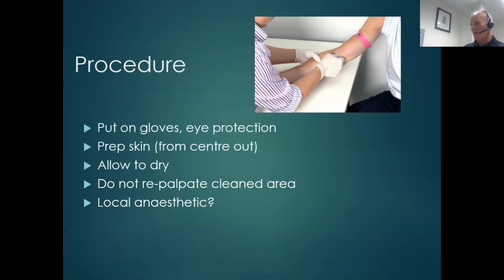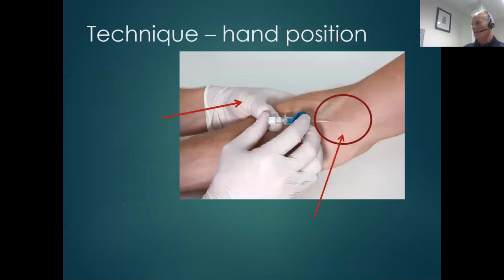Are we using a local anesthetic? The better you get at this, and again, it's all hypersensitivity to needles and patients' reactions, we may need it in some cases, but most times, if you're doing it correctly, it doesn't hurt that much. Uncap the cannula and unlock and rotate, so we want to make sure that the cannula can slide off very easily. Technique, again, many people have different ways of holding a cannula. Many people have issues with one cannula compared to another. Just make sure you get used to what you're doing.